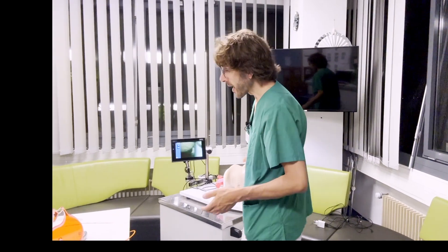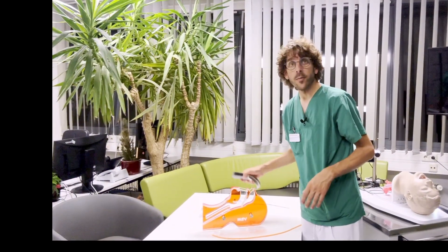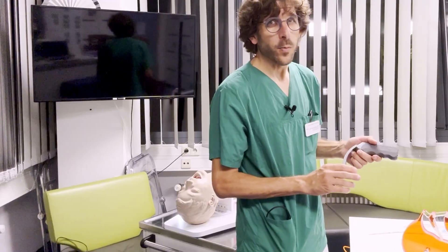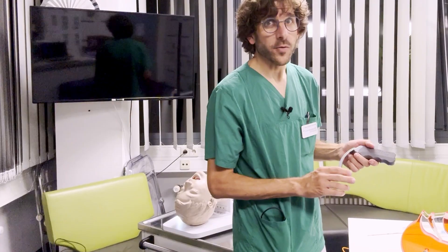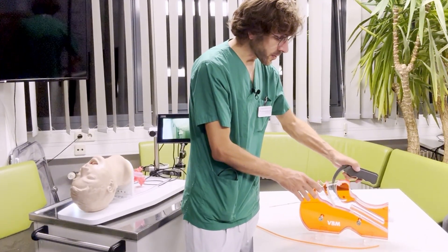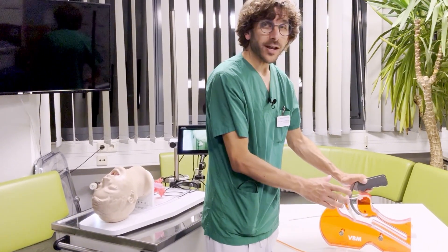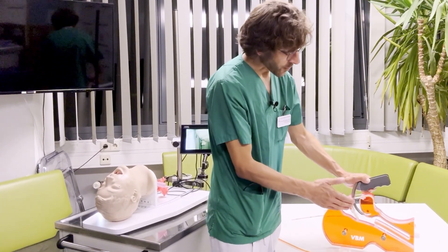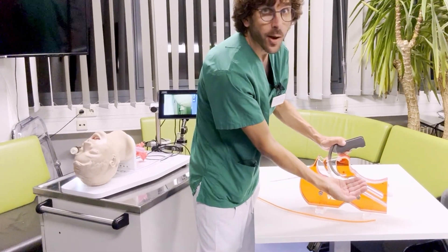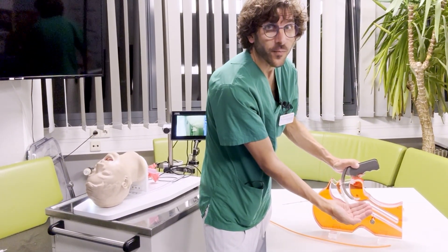In contrast, when using hyper-angulated blades like the D-Blade, we don't worry about producing a straight line — we just move around the tongue. But that leaves us at a position where we are looking up at the glottis.